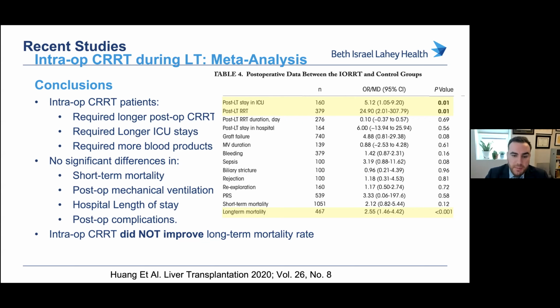So they looked at patients with significantly higher MELD scores with intraoperative CRRT as compared to patients with lower MELD scores without it. And yes, those patients are sicker. Yes, they will require longer ICU stays. Yes, they'll probably require post-operative CRRT, but they didn't have longer hospital stays. They didn't have longer short-term mortality.